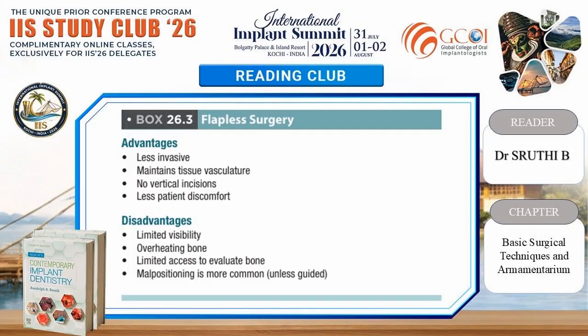Flapless surgery. Advantages: less invasive, maintains tissue vasculature, no vertical incisions, less patient discomfort. Disadvantages: limited visibility, overheating bone, limited access to evaluate bone, malpositioning is more common unless guided.